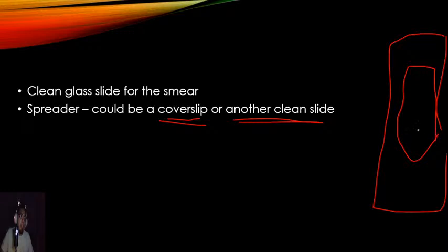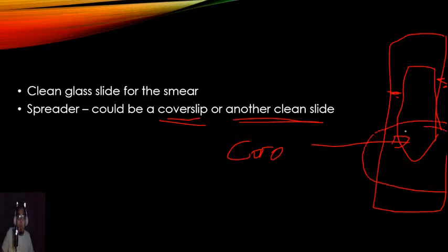Okay, it's going to be tongue shaped, and there needs to be a space in between this one. All right, needs to be a space here on this side. Pardon the drawing, but you need to have a tongue shape, and you need to have what you call a corona at the edge of the tongue. They call it the corona. Why is it the corona? Because this is what you call the top of the smear, the very top of the smear, the part of the smear that the microscopist would look at. Okay, so this is the corona.